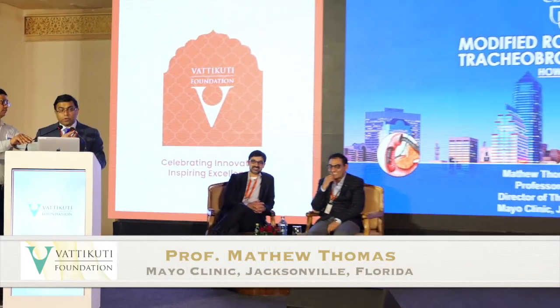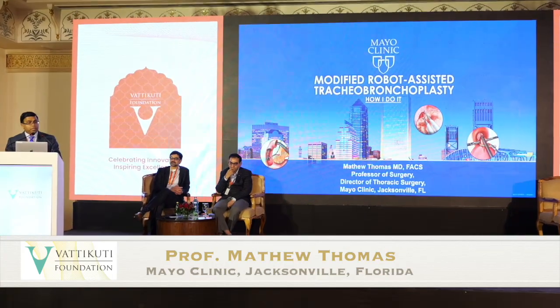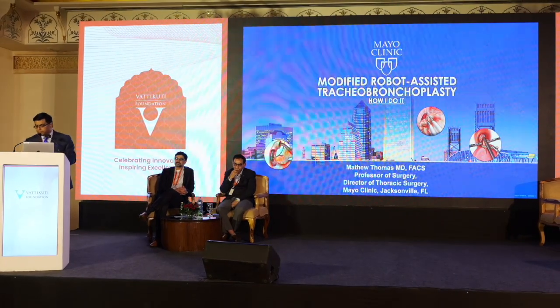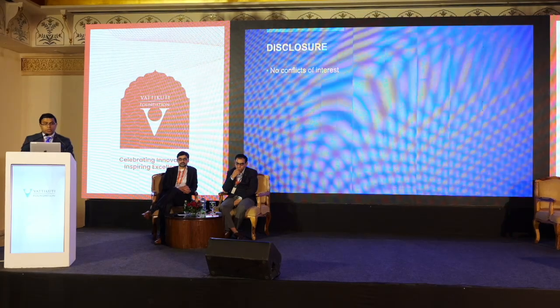I would like to thank the Vattikuti Foundation for giving me the opportunity to present on modified tracheobronchoplasty using a robotic assisted approach. I'm from the Mayo Clinic in Jacksonville, Florida. I have no disclosures.